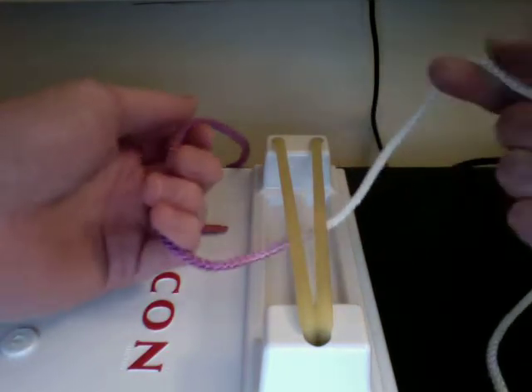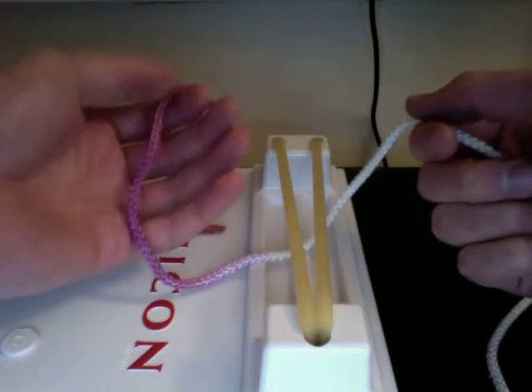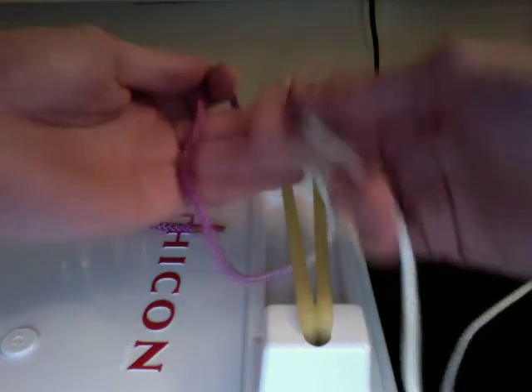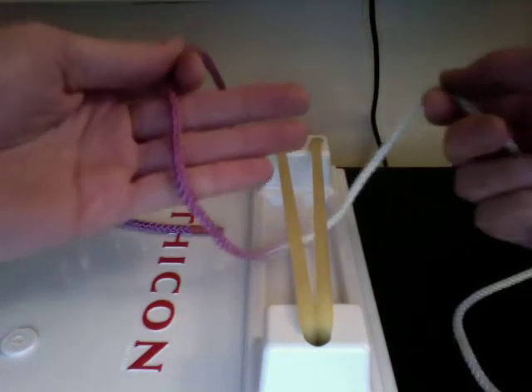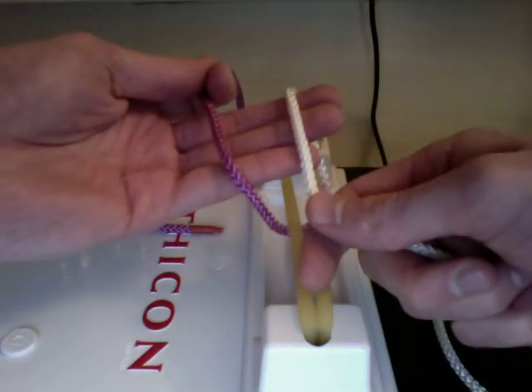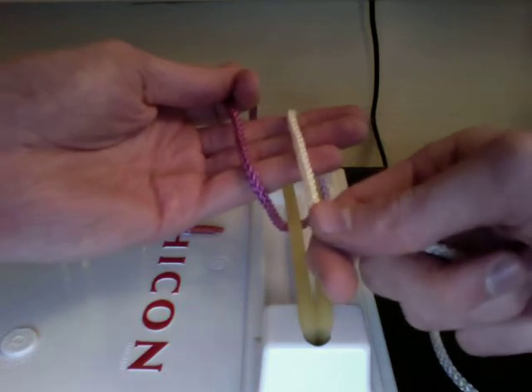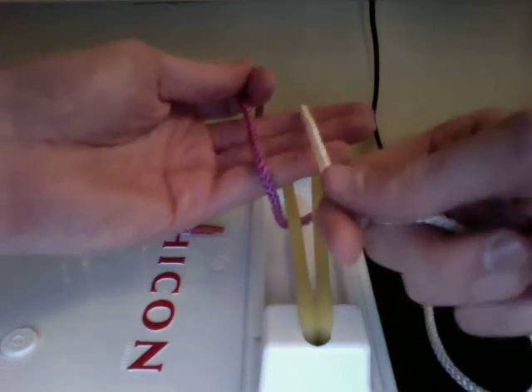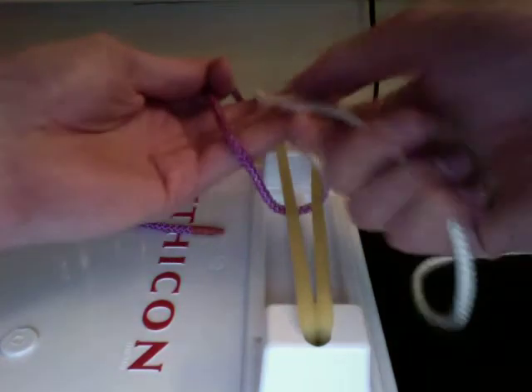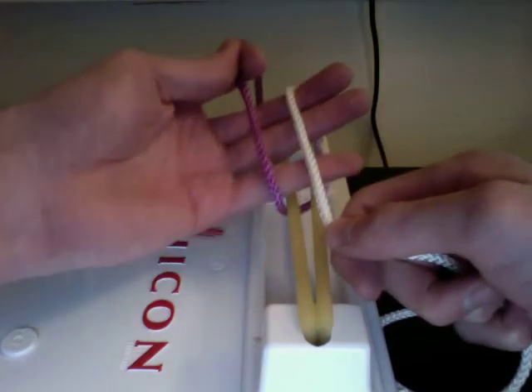The first thing you're going to do is pinch the purple strand in your left hand with the first two fingers and just let it lay nice and easy across your other fingers. Then you're going to wrap the white strand around your left three fingers so that it's going the opposite direction of the purple strand. This is always going to be the case in both moves — purple going away from you, so the white strand needs to come towards you with the free end down near the pinky.